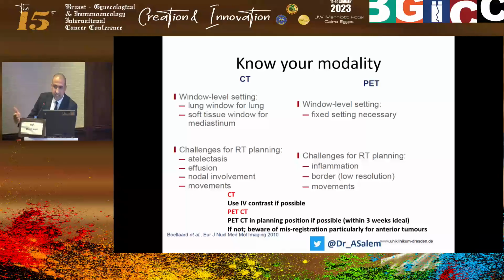Ideally you should have a PET CT scan for obviously diagnostic purposes. Sometimes you can do a PET CT scan specifically for planning purposes. But if you're going to do it for planning purposes, it has to be quite close in terms of time to your CT simulation. Sometimes people like to do fusion between the PET CT scan and the CT scan. But be careful if you do this, because there can be a lot of misregistration between the images. So you have to be very mindful of the registration issues that can occur.